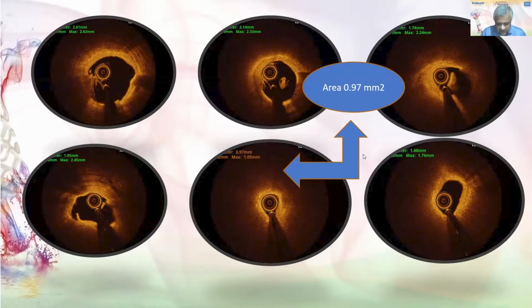So the point I'm trying to make is that we could get all the data, we could get all the information, we could get the amount and distribution of fibrous plaque, and some amount of the disruption has already been done by the 2.5 millimeter balloon.